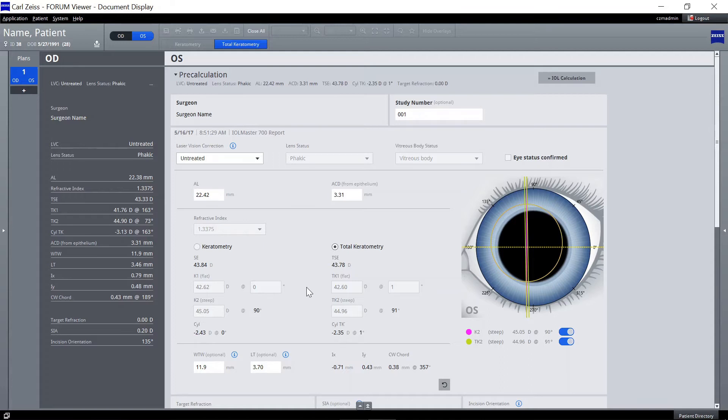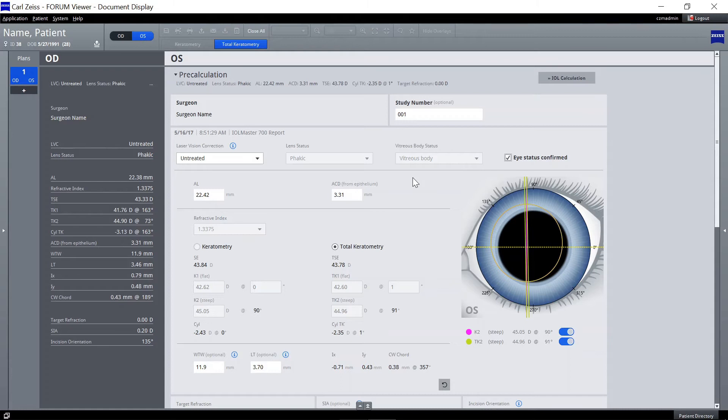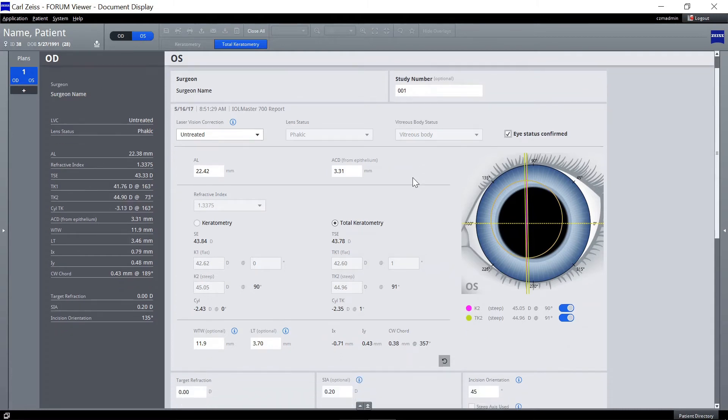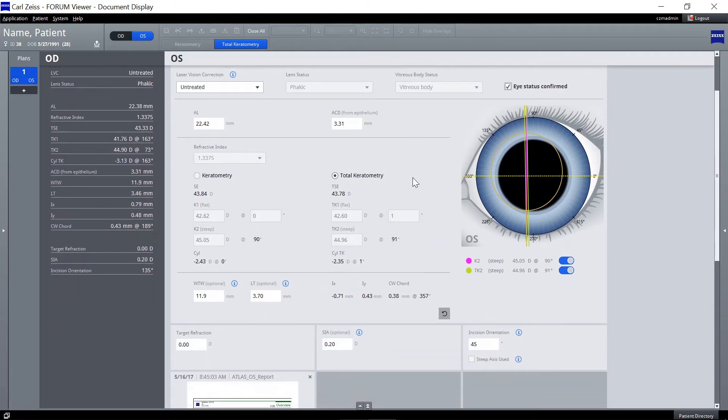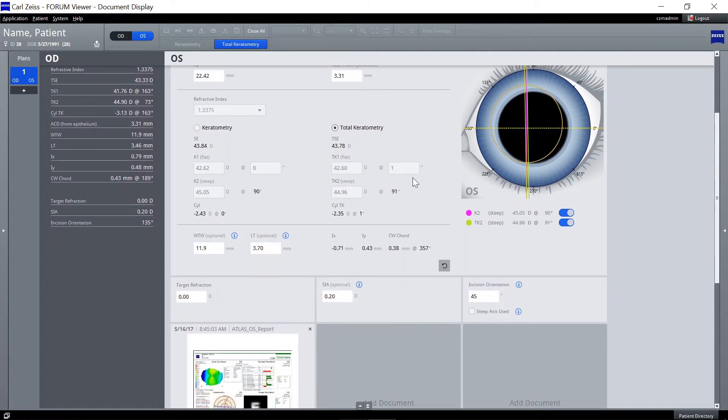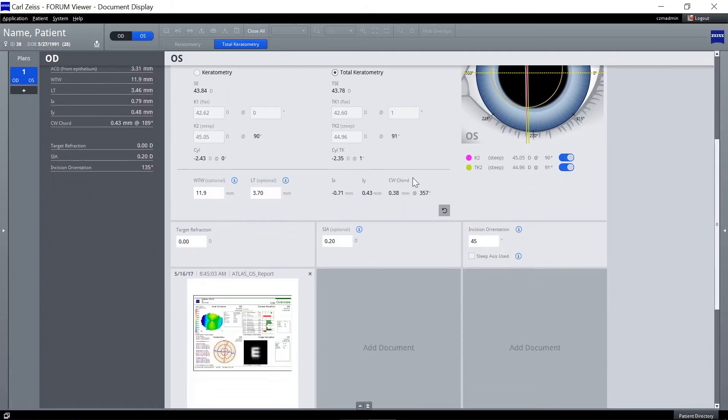Confirm the eye status of the patient as imported from the Zeiss IOL Master and adjust the laser vision correction if applicable. Review the biometry and keratometry data carefully needed for your IOL decision.